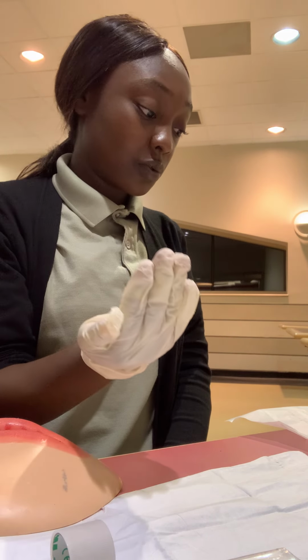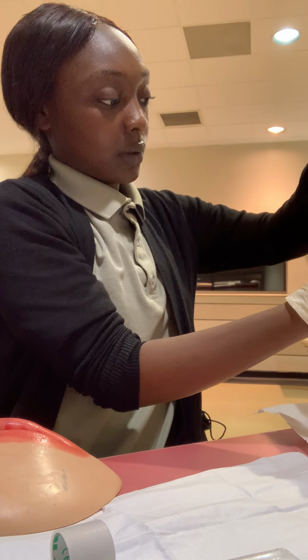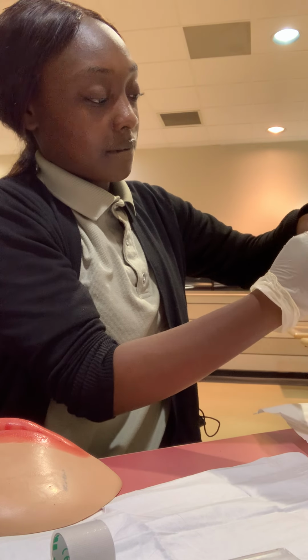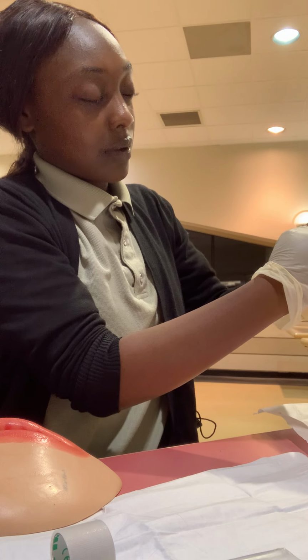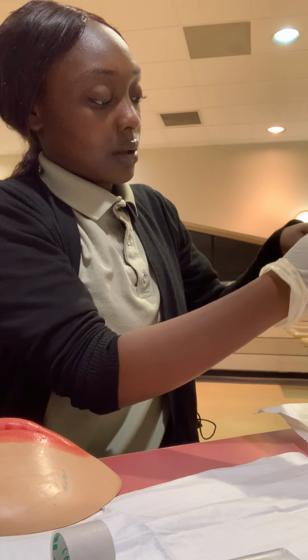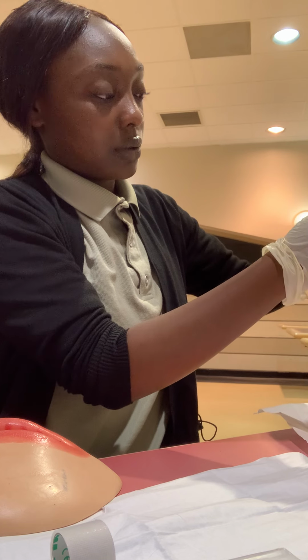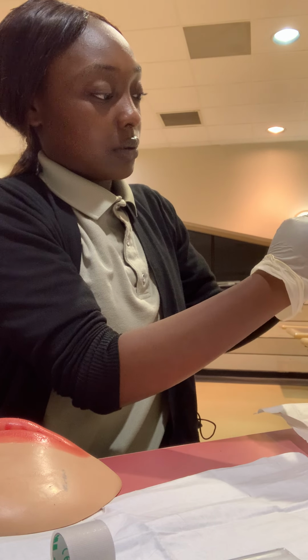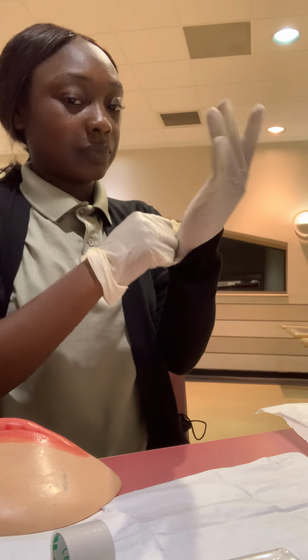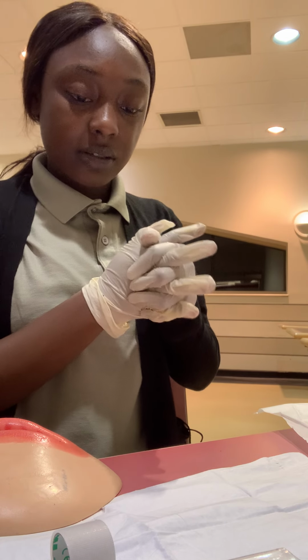Now I'm going to scoop, keeping it over the sterile field. It's still over the sterile field. Okay, our hands are together now.